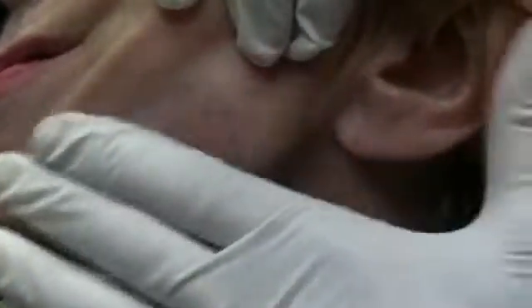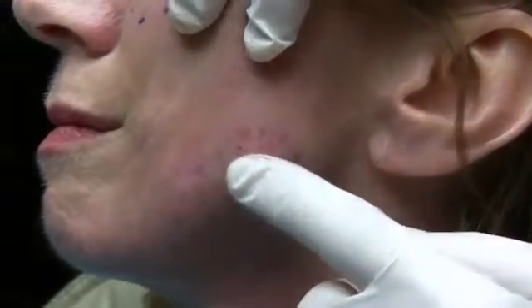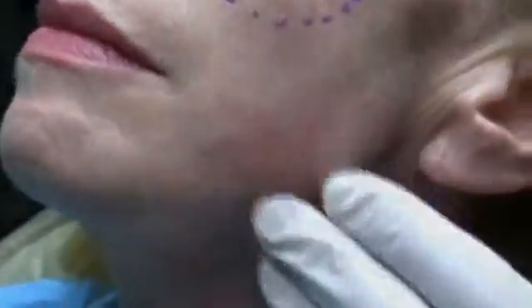All right, so there is 2 cc's of Perlane, and now we have a good prominence here that would mimic her masseteric region, and from the side we've restored that contour. It's probably somewhat difficult to tell. Put your chin way up because of the lighting, but that worked out quite well.